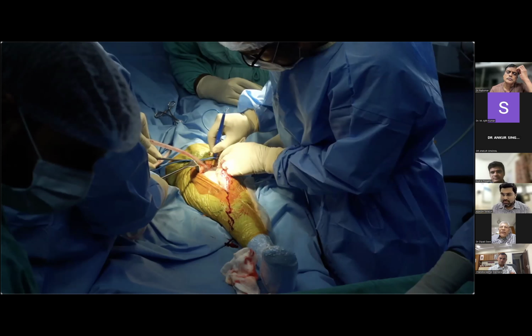If we want to extend the rod or something, then we take the extra cement. But the mold which we have, they're autoclavable molds. So it takes that much of cement, which I think is sufficient. Except, as I said, if we increase the poly thickness to 22.5 or 17, or usually the flexion gap is more, and for gap balancing, if we want to have more, then probably we have to use more cement. But up to 15, the 2 pack cement for tibia is okay. If the poly thickness is more, we have 1 more pack.